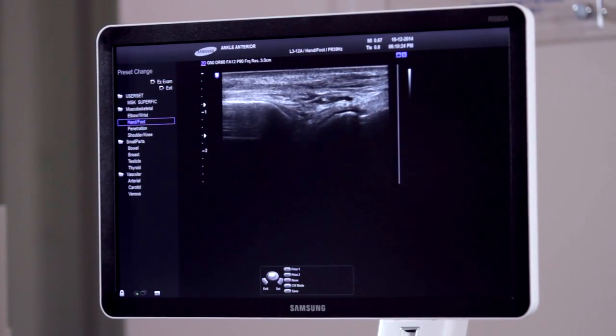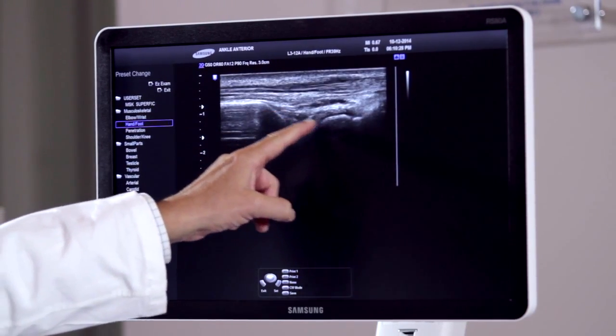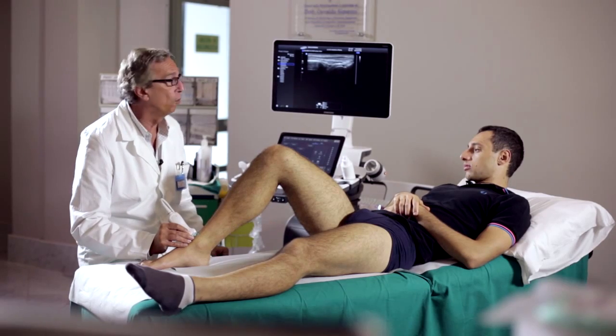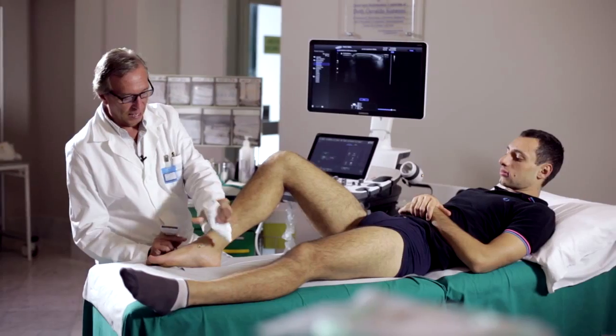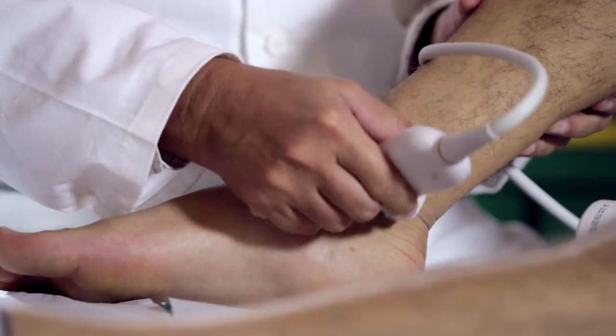This scan is very important because it allows the identification of the joint capsule and displays a joint effusion, where there is the presence of fluid. We now consider the anatomical components of the ankle's medial compartment, and we start with axial scans to study the first tendinous component.